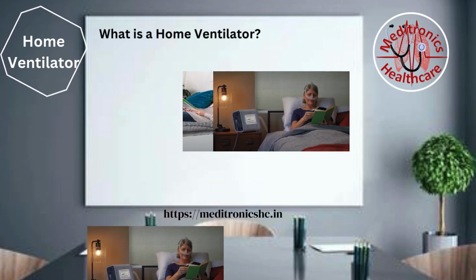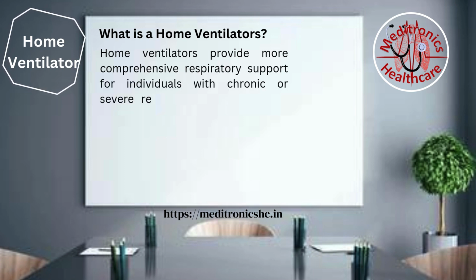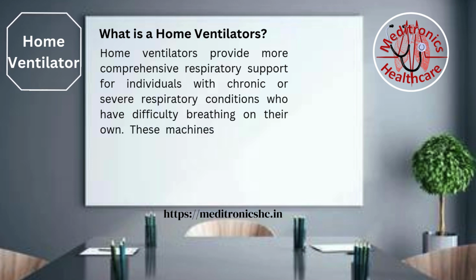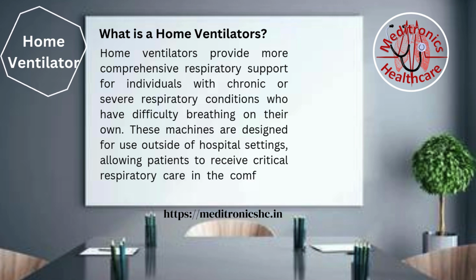What is a home ventilator? Home ventilators provide more comprehensive respiratory support for individuals with chronic or severe respiratory conditions who have difficulty breathing on their own. These machines are designed for use outside of hospital settings, allowing patients to receive critical respiratory care in the comfort of their own homes.